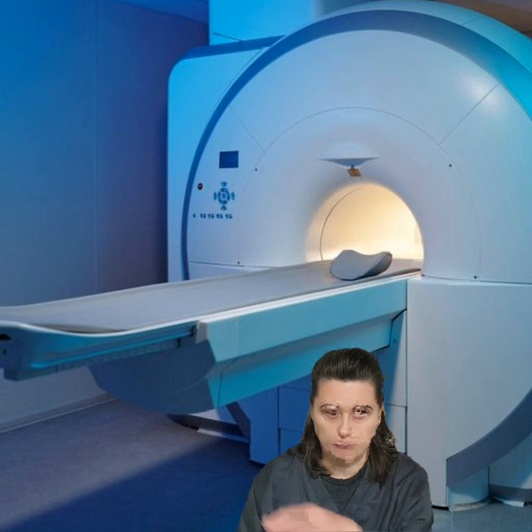For axial lumbar, I use the sagittal plane because I can clearly put the perpendicular angulation towards the spinal cord. Slice coverage will be from T11 all the way to S1. The saturation band will be placed anteriorly.